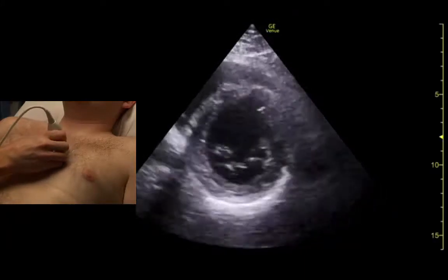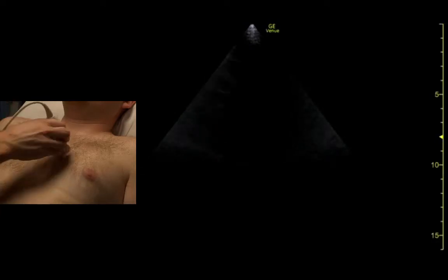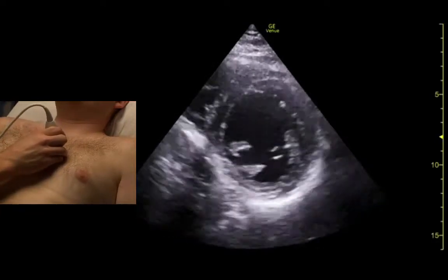From there we just take that view, rotate 90 degrees, so the indicator is at about 1 o'clock. We want the ventricle to look like a circle.